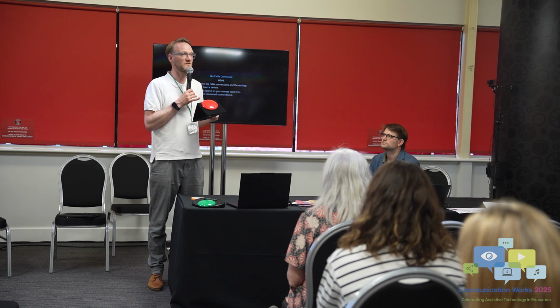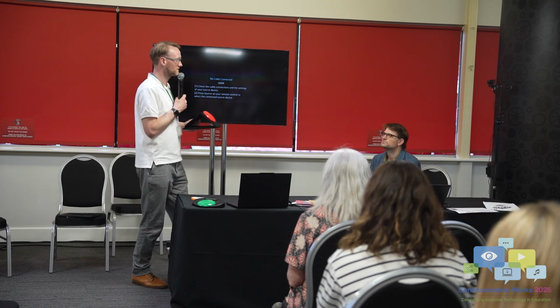So often we'll be exploring. That's kind of my job, Charlie's job. We go out, we look at what type of mounting system would work, what type of switch would work, and we support you in it. When you start, there's nothing wrong with just using a simple push button switch. I don't get panicked about the type of switch. Sometimes it's just problem solving, and this switch might actually help later on, and their needs do change throughout the years.